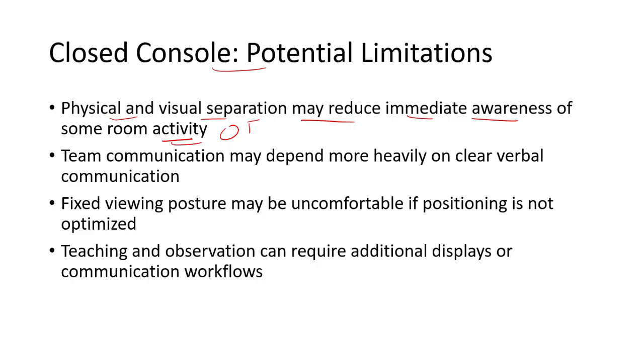Team communication may depend more heavily on clear verbal communication. Visually he cannot see the team, so he can only do verbal communication. He is only seeing the surgical field and the robotic instruments, so he is completely dependent on verbal communication.